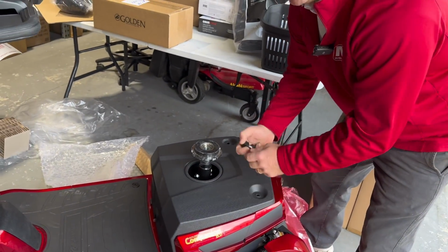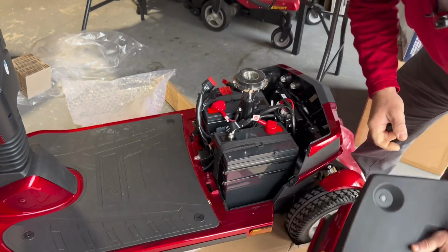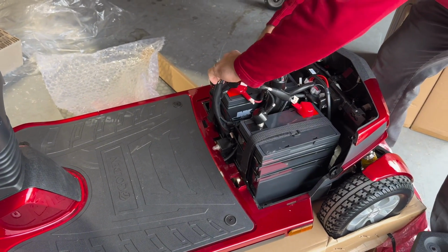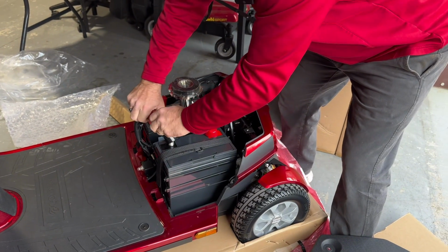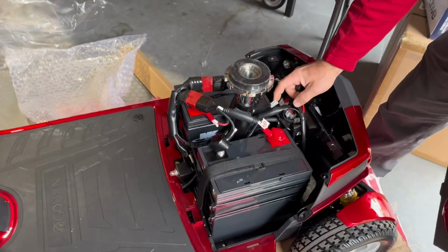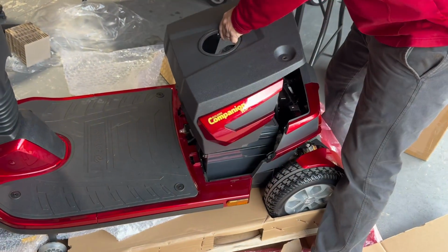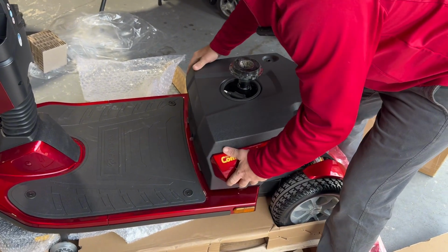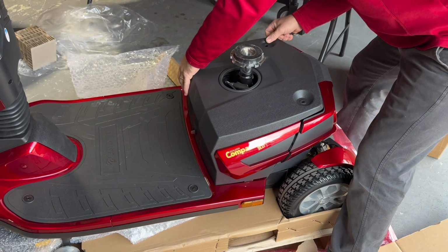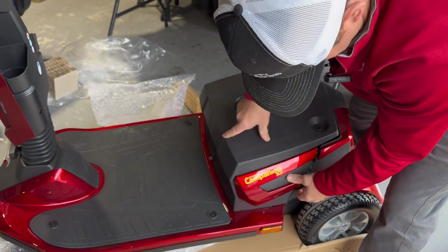And if someone's shorter, just remember when you put an elevated seat, it does make the seat post a little bit higher. Here's your batteries, and then you have to hook this stuff up. Very easy, just plug and play. If you get it wrong, you'll figure it out. And then you might see this extra cord right here. That's probably for if you had an elevated seat, so I wouldn't worry about that. Then you're just going to put this right back on. Make sure you get it in.